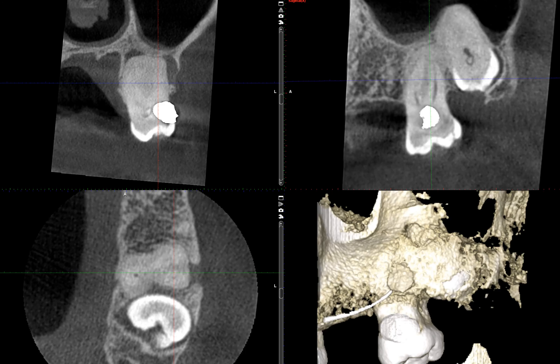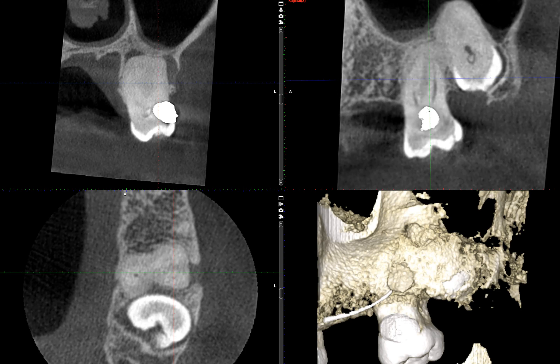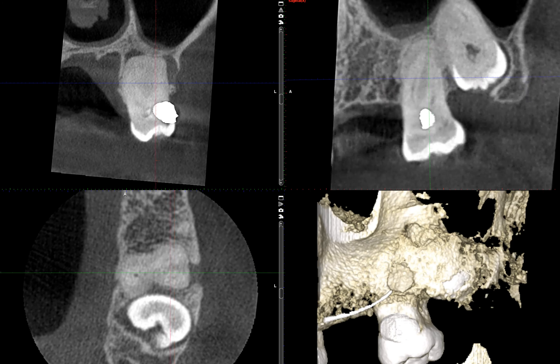Hi everyone, this is Dr. Kim. For this quiz, I want you to pay close attention to the overall root anatomy and the PDL space of tooth number 15. Let's start out with the sagittal views.